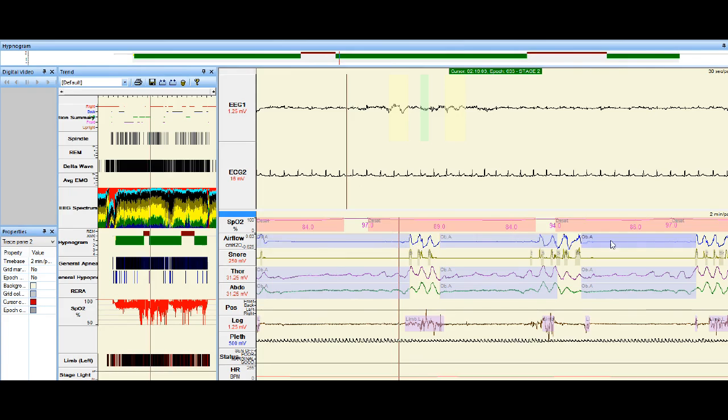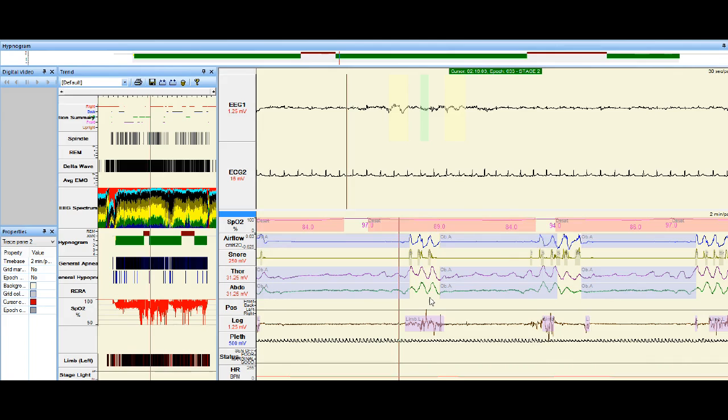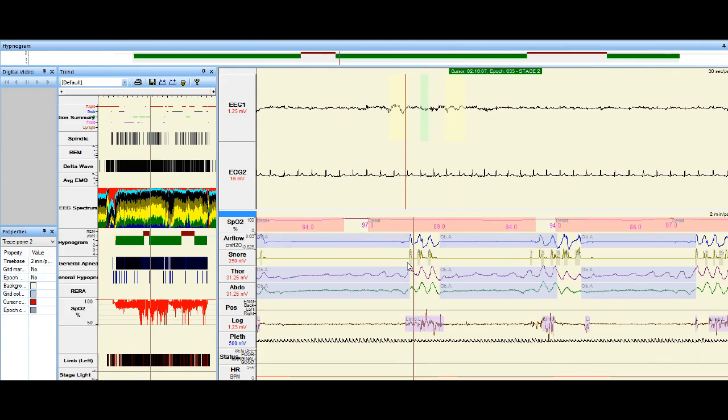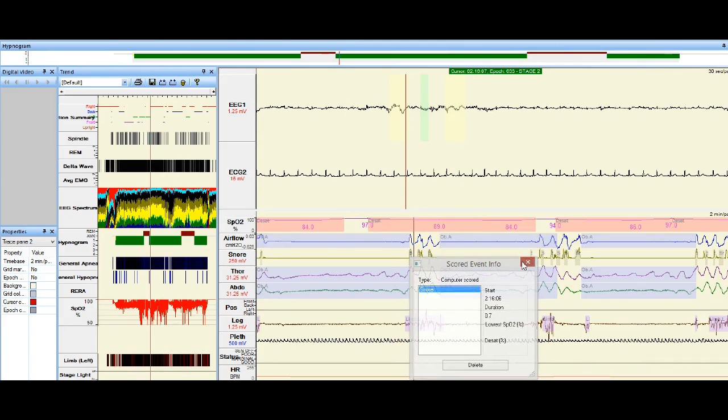This is a two minute subsection across here. So there should just be these nice inhalation, exhalation, like a sine wave. And then you can see at this point in time where that patient breathes for three or four breaths, not long, there's some snoring with the green. You can see the green there. That's a bit of snore happening.